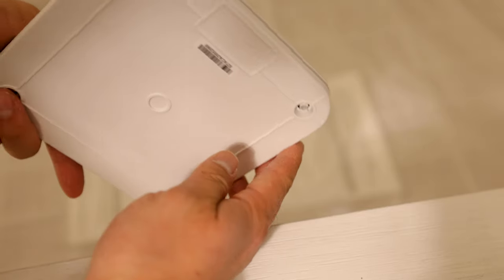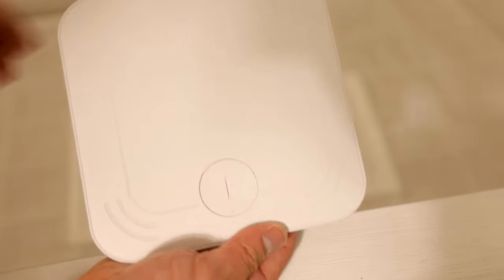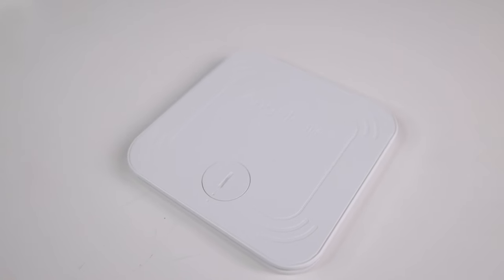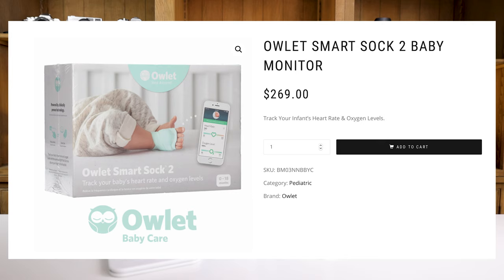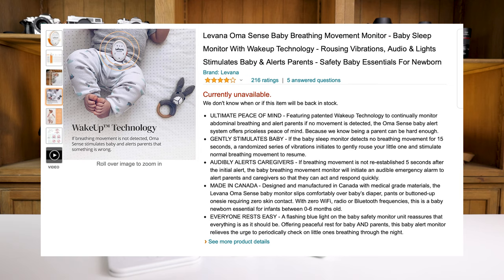Currently, this is the only product on the market that monitors your baby's breathing with a sensor pad underneath the mattress. The great thing is there's nothing to obscure your baby, nothing they have to turn on or strap on. There are other products where you can strap something to their ankle or clip something to their diaper.